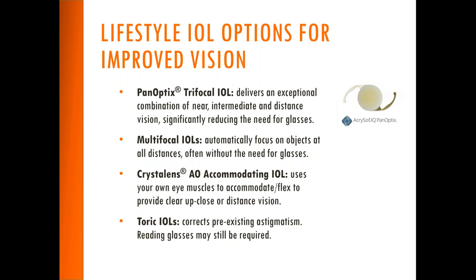We do have other options that we can provide to provide a greater range of vision. There's a couple different types of multifocals that can be divided into a multifocal implant or an accommodating implant. These two different technologies are entirely different, but they're trying to give you more near vision and reduce your dependence on glasses. Our multifocal choice that we're using currently at Skyline Visions is called the PanOptics trifocal implant. It's been very successful for the right candidate and can deliver distance, intermediate, and near. Prior to this implant, we've had multifocals that really did distance and near, but had an intermediate vision that was not quite as sharp as the other two distances.